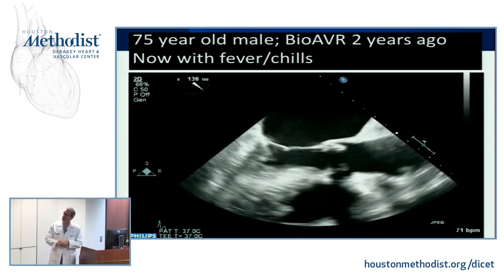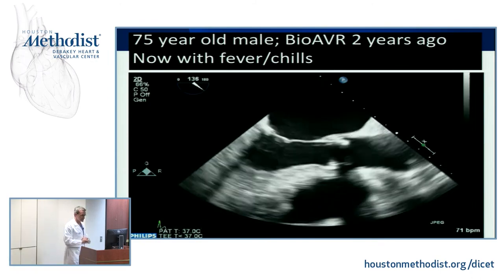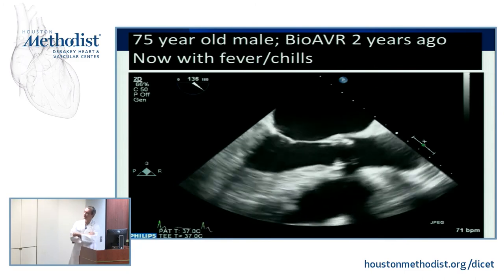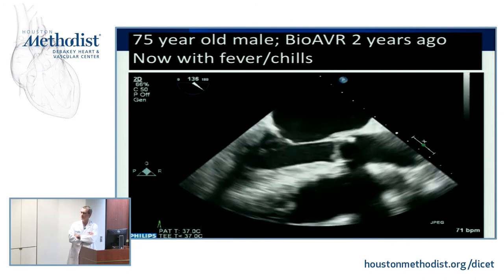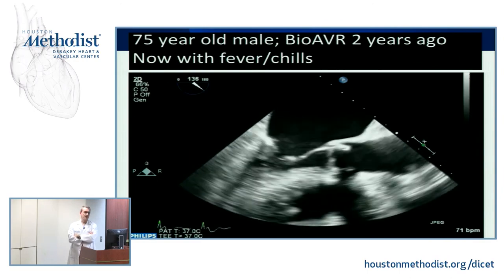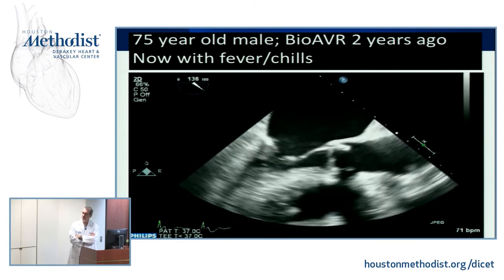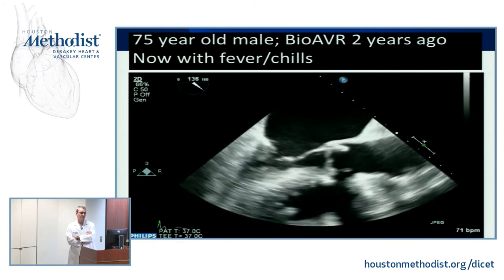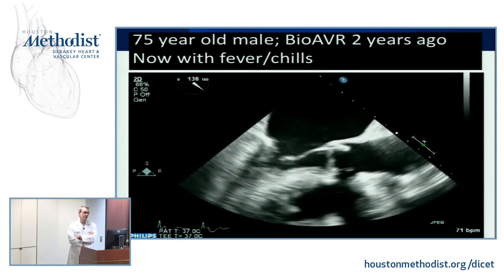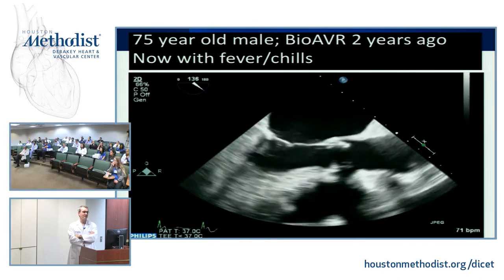This is a gentleman with a bioprosthetic valve placed 2 years prior. He comes into the hospital with fevers and chills. This is a fairly standard echo, done at our institution. Not feeling great, this is a reasonable screen for endocarditis of a bioprosthetic tissue. Anybody see any concerns? If you see a concern, put your hand up.